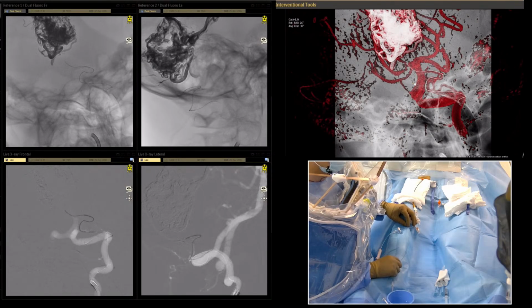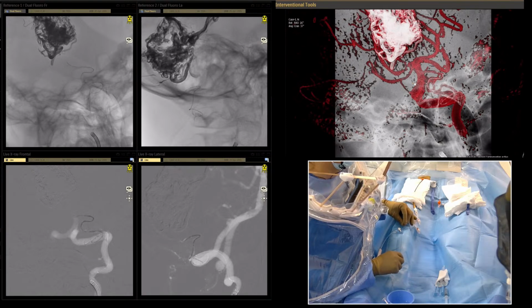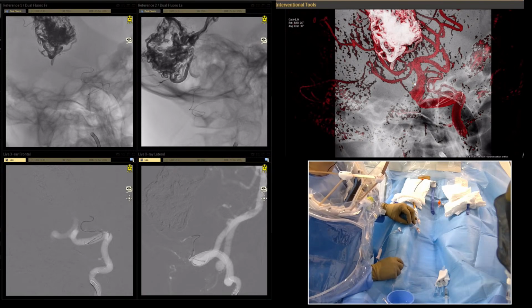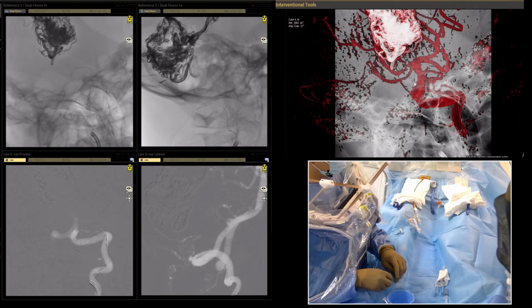Okay, now it's proceeded. It's the beauty of using Sonic 1.2. And there is a bit of angulation. Okay. It's not so stable.